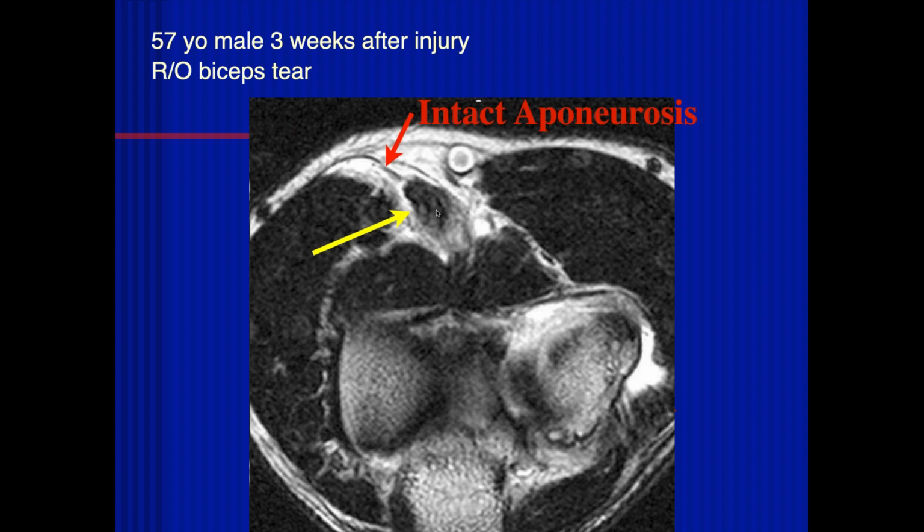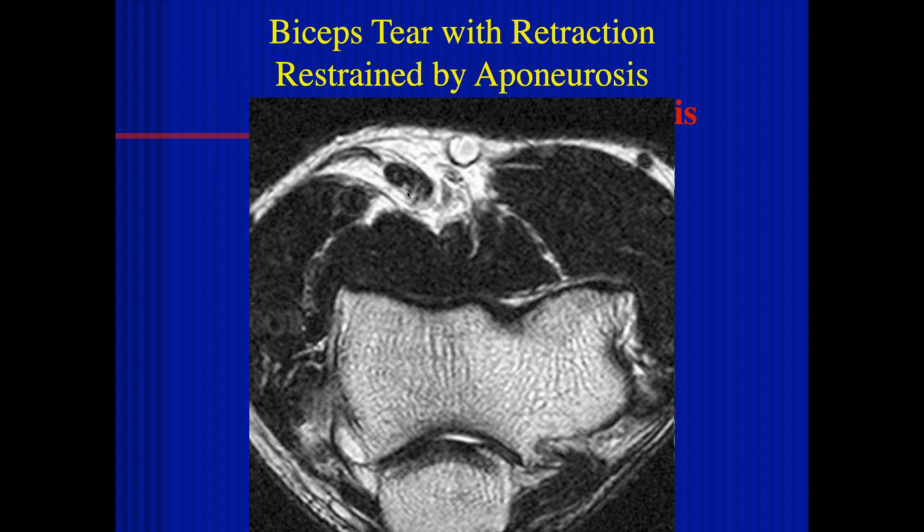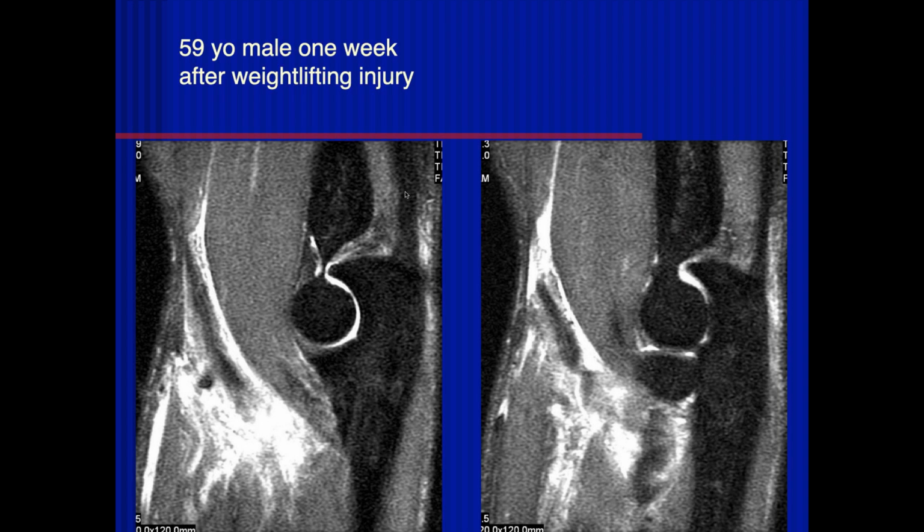And a surgeon would like to know, you need to give them a sense of exactly where the distal end of the tendon is, what the integrity of the tendon is. This one is very, very severely tendinotic, and whether the aponeurosis is intact or not, so that they know where to go looking for the tendon if they're going to repair it. And again, very tendinotic tendon going more proximally. Okay.